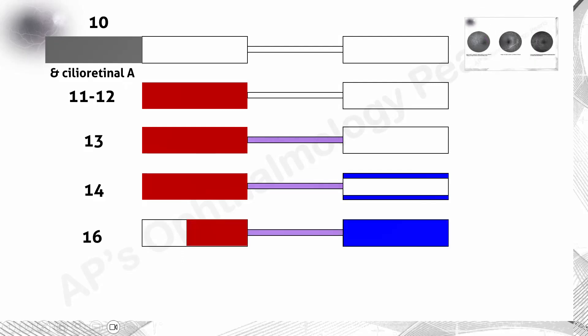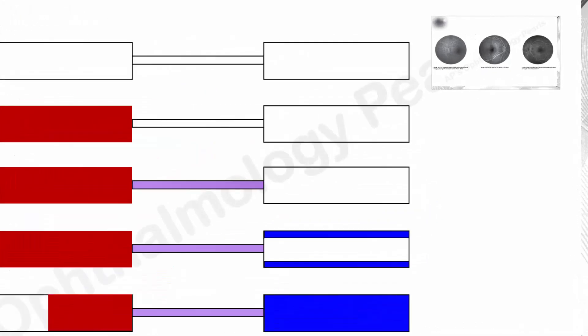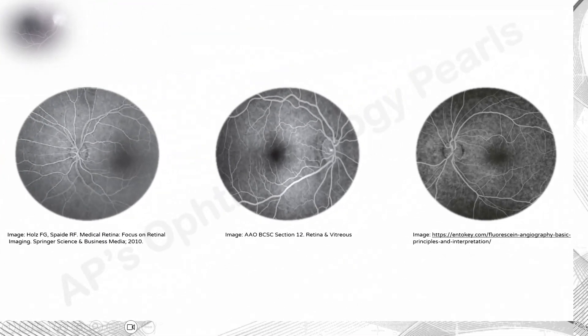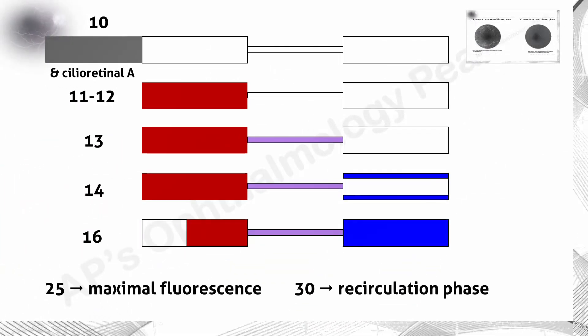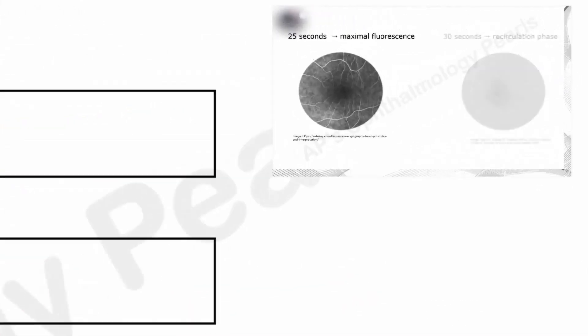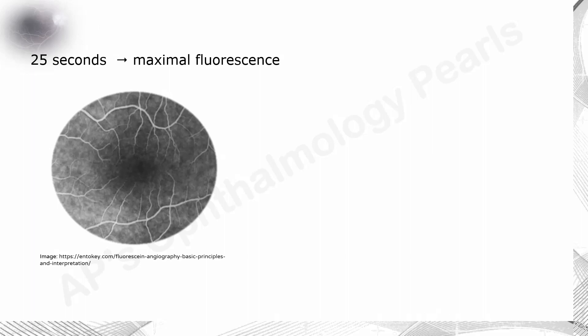During the venous phase, at roughly 16 seconds following dye injection, dye fills the entire lumen of the venules. Maximal fluorescence is observed approximately 25 seconds following injection, at which time the fine perifoveal capillaries can be best imaged. This is called the peak phase of the fluorescent angiogram.